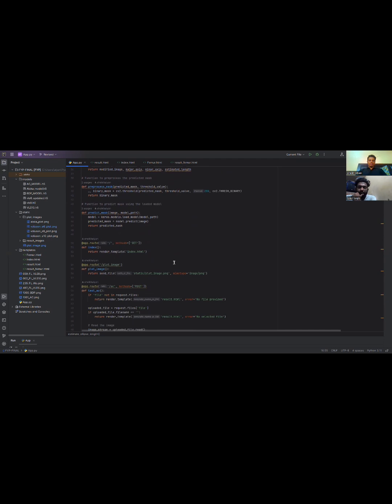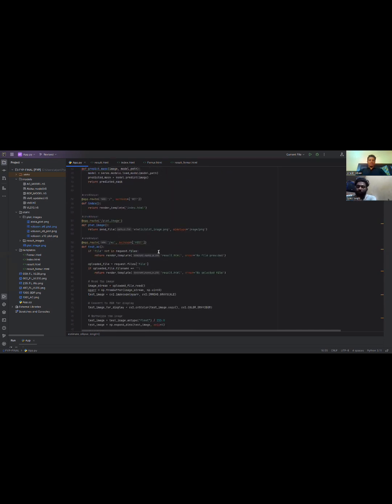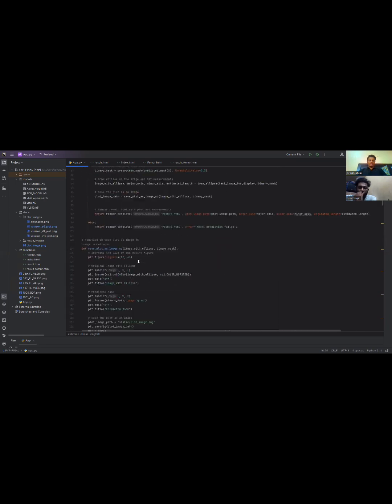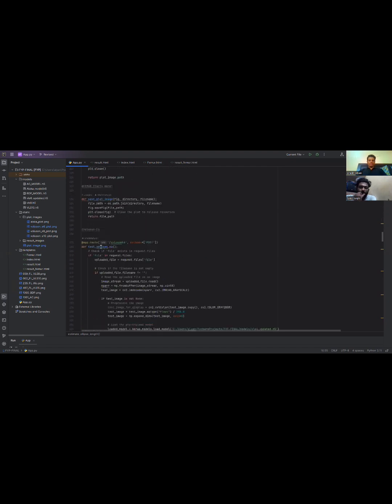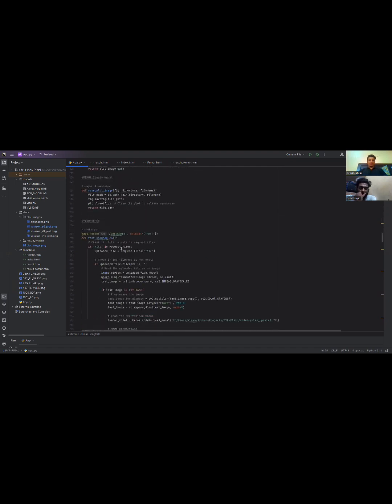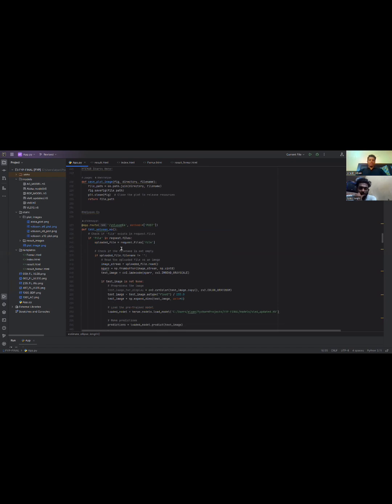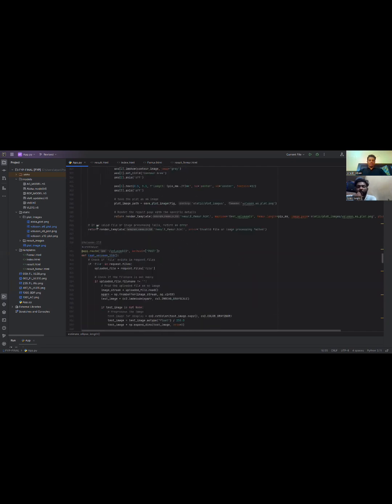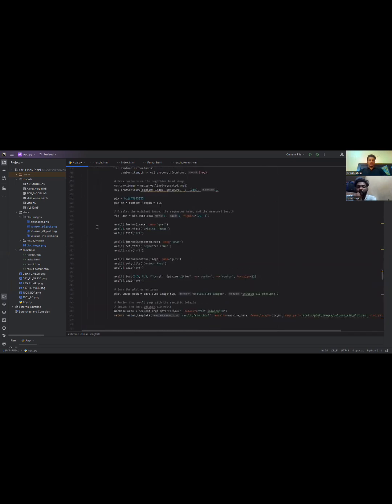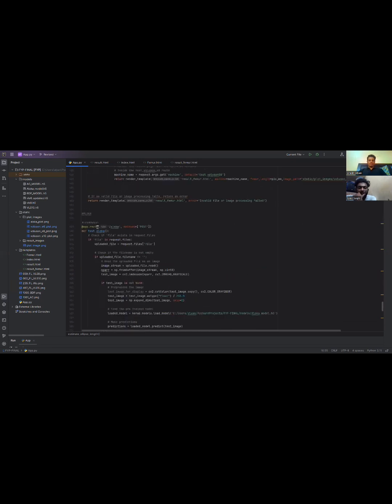For each, we make the API of each machine, each parameter, like AC and BPD. And as you know, there are four machines of femur, so each machine has a different route. Here is the route of Voluson E6 and Voluson S10, Voluson S8, and following Voluson S8, here's Aloka.